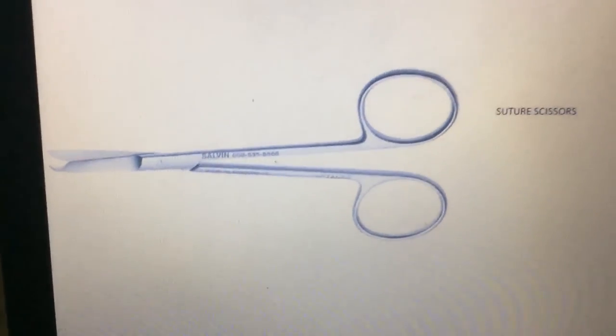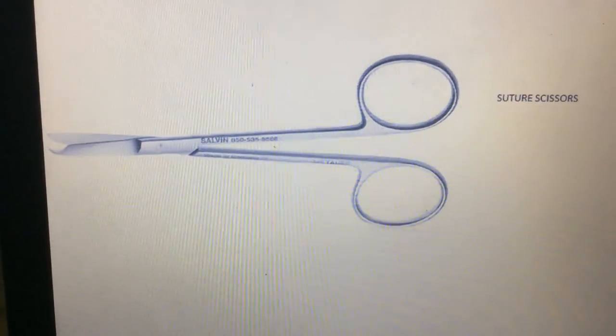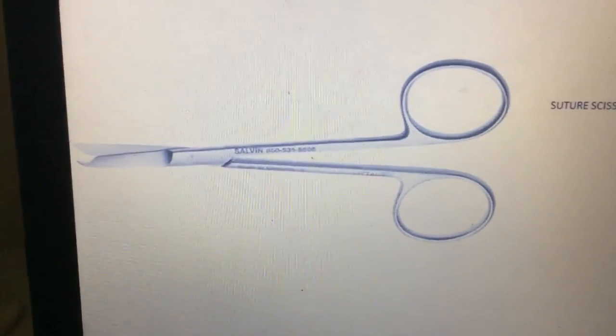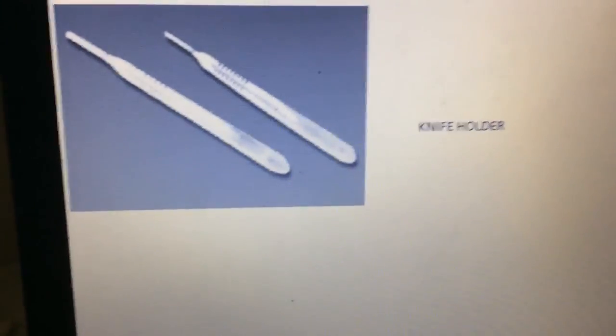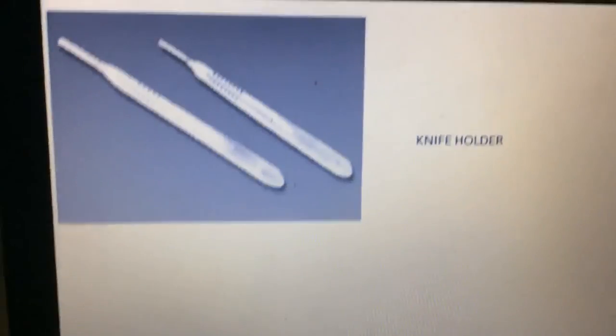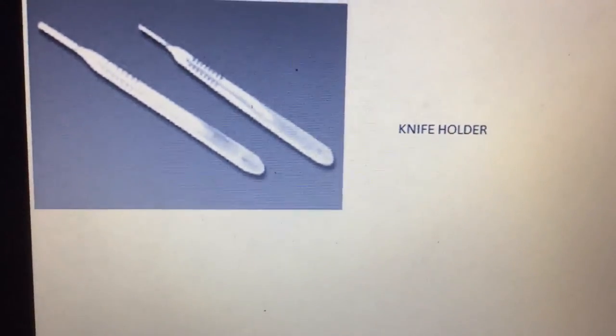Next, this one is suture scissors. Suture scissors are mainly used to cut sutures after suturing. This one is a knife holder or blade holder. The blade holder is used to hold the surgical blade for cutting.